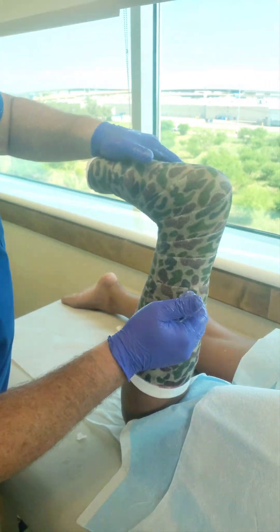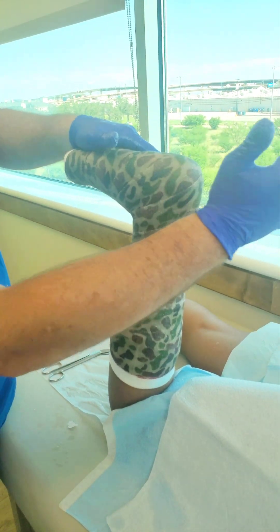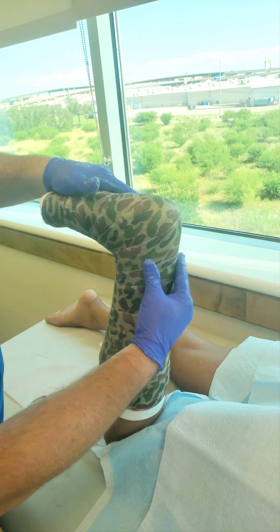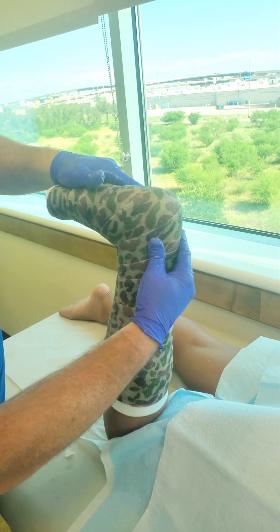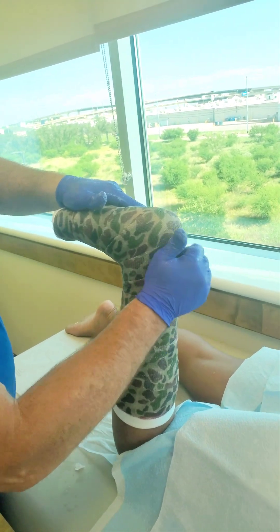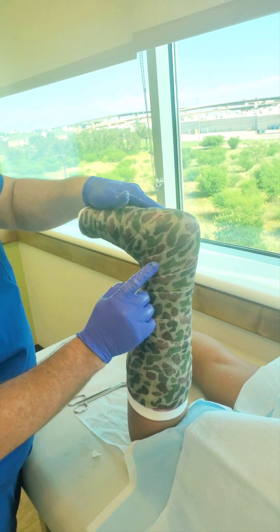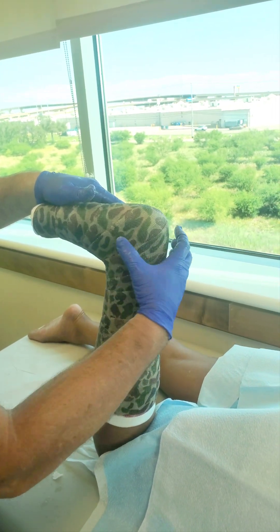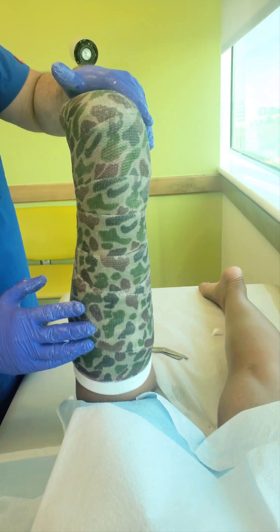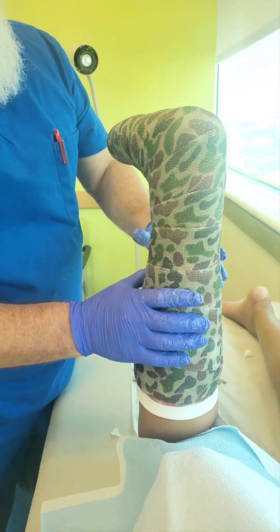The next mold you can do is the Achilles mold. It's not making the back of the cast tighter — it's making it more fitted. You're going to use your hand and mold into the indentations where most of us have a nice little crease back here where the Achilles is. Don't leave finger indentations because those leave hot spots. Just leave a nice little mold there, and it keeps the cast from wobbling around, especially if they have an ankle injury.